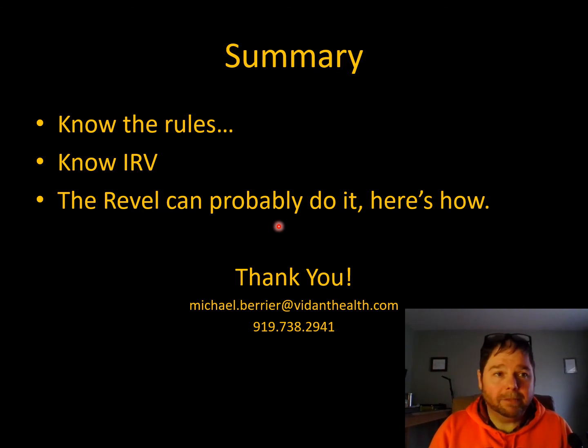If you just can't oxygenate somebody any other way, then while you're thinking about doing IRV, you should probably also be thinking about getting on the phone and saying, this is where I'm at, this is what I'm stuck with. Do you have any other suggestions before I go to this next thing? And finally, our ventilator can probably do what you want it to do. Between looking at that reference and the mode conversion chart, it'll tell you how you can do what you want to do. It's just a matter of understanding the language and understanding how our ventilator translates those things from other ventilators.